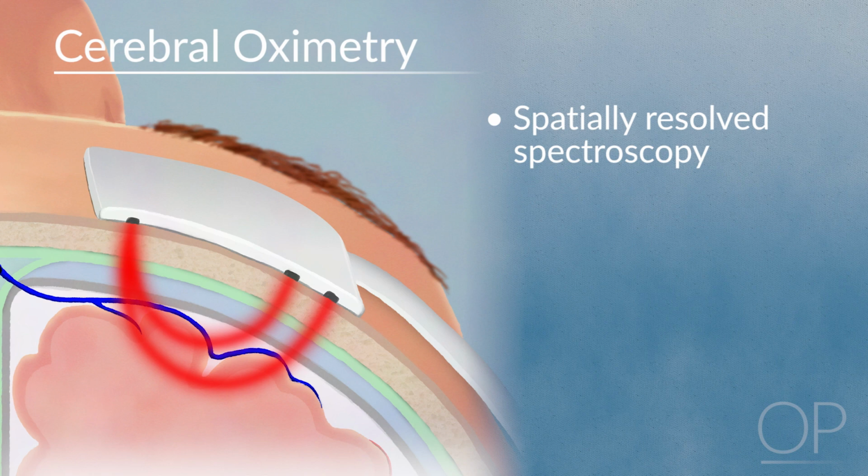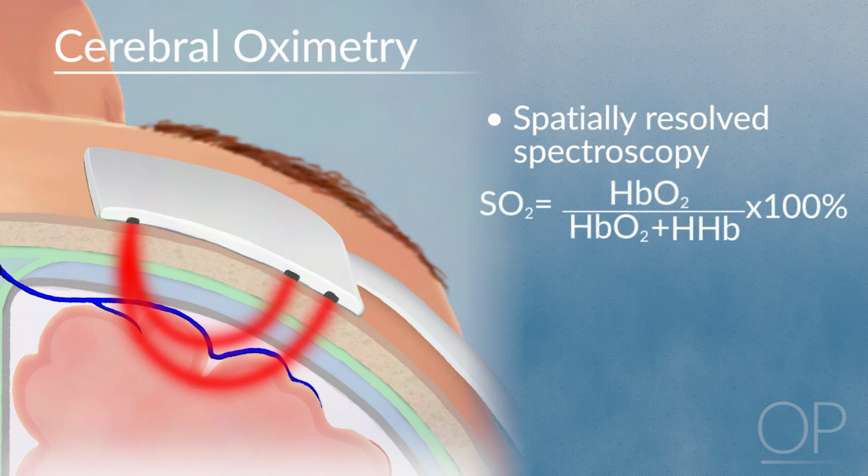As I said earlier, the cerebral oxygen saturation is a ratio of the oxyhemoglobin to total hemoglobin concentration expressed as a percentage. The varying commercial oximeters display cerebral oxygen saturation in varying forms, such as rSO2, ScTO2, SCO2, TOI, but all represent cerebral oxygen saturation.